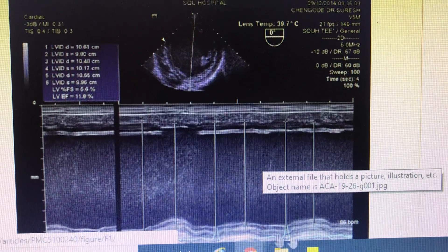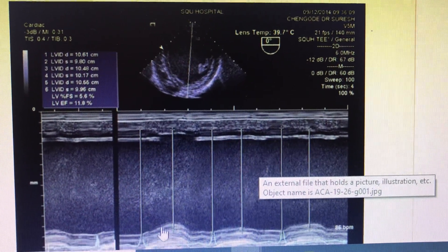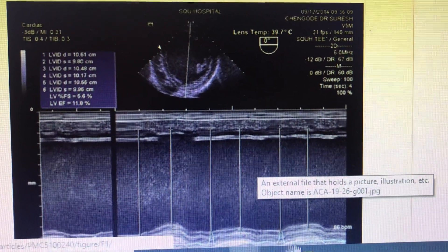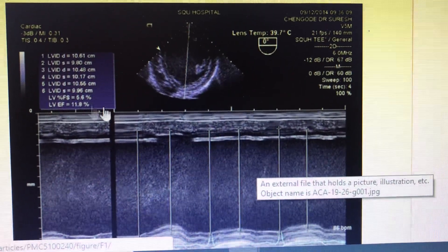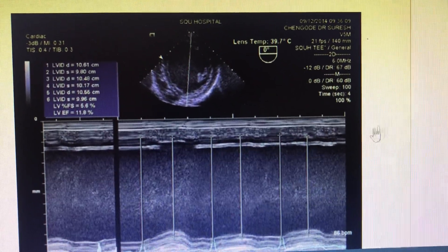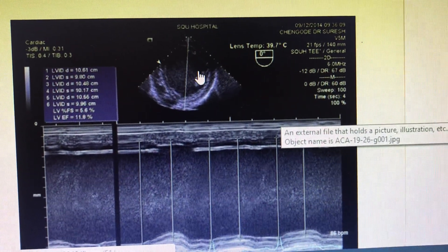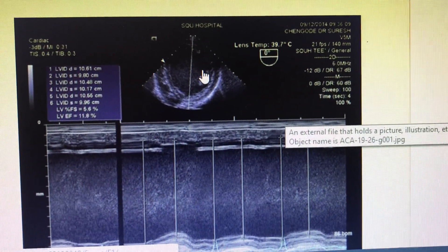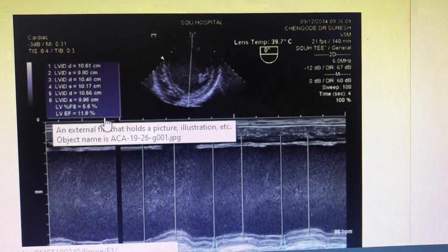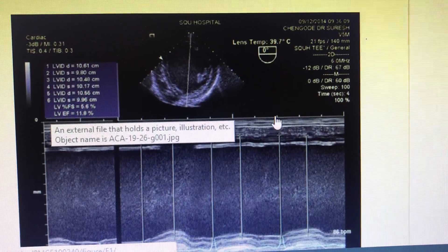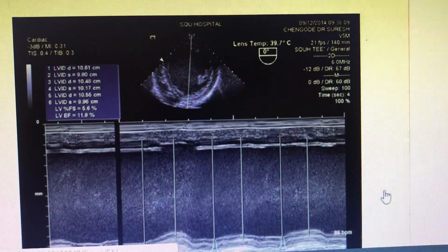You can see there is minimal movement in the heart. The septum is not moving at all and the posterior wall is showing only some flittering movement, so the LV ejection fraction is coming very much low. This measures the fractional shortening rather than the actual ejection fraction per se.